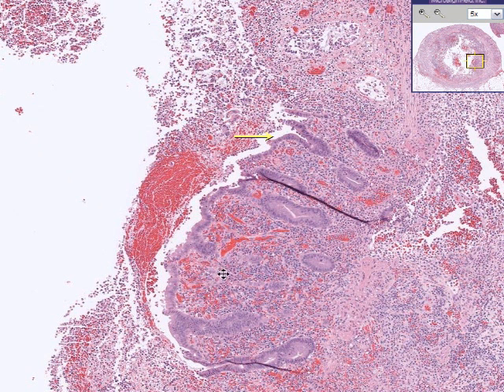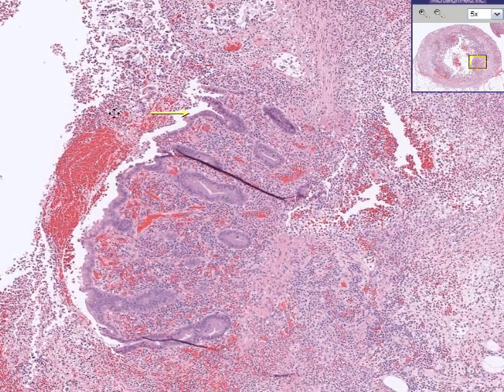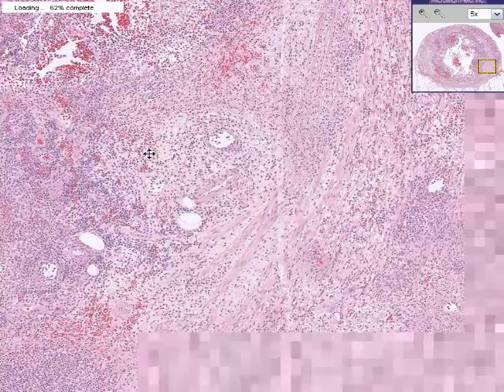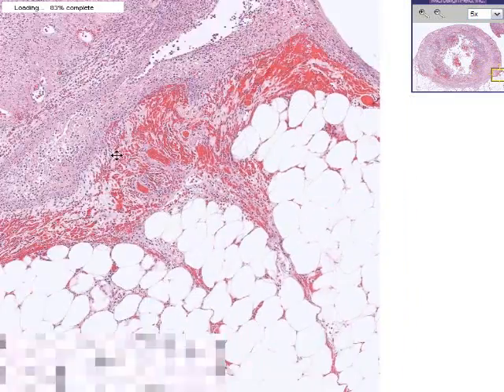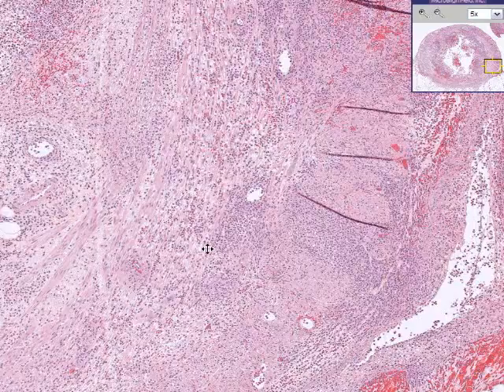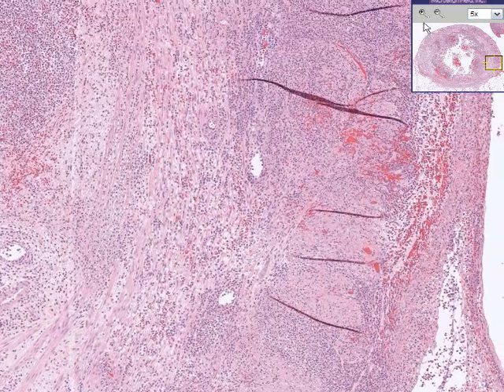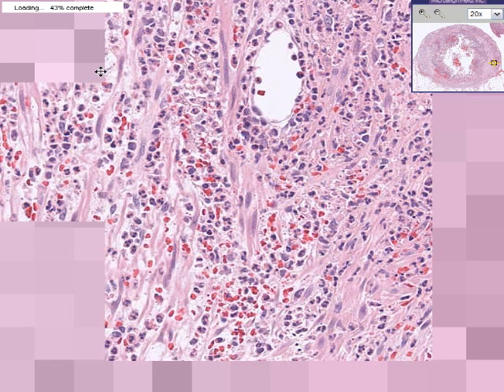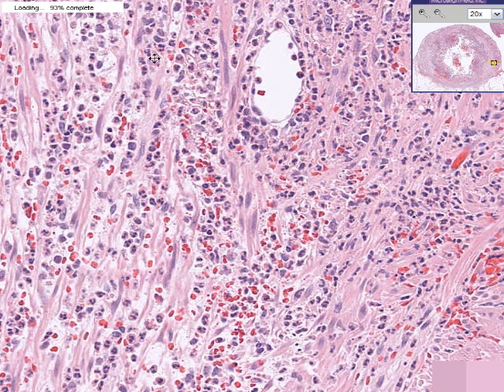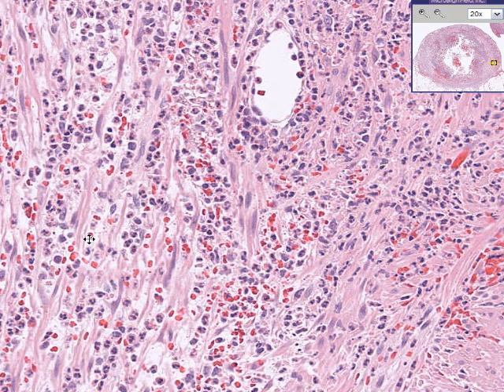That should finish off our view of acute appendicitis. We see inflammation in all areas: mucosa, submucosa, muscularis, serosa, and even in the fat. But to emphasize one very important thing — from a diagnostic point of view, the criteria needed to correctly diagnose acute appendicitis is to see neutrophils interspersed between the smooth muscle layers. This is a diagnostic field.